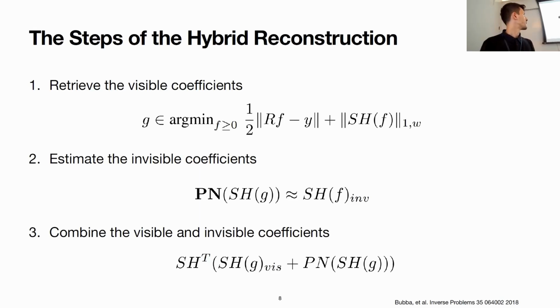The invisible mask applied to the output of the first step is approximately 0, because this represents the invisible parts, evidently, and to retrieve that, we have the approximation with the inference that the trained PhantomNet does. So the final formula that you see at the bottom represents the actual reconstruction, which takes into account these two components.